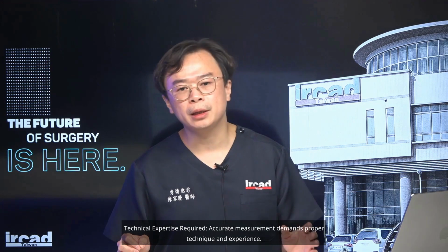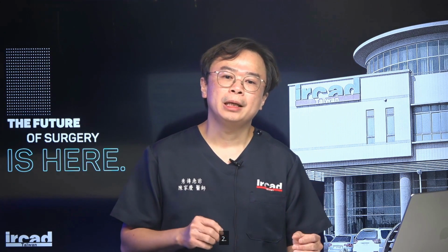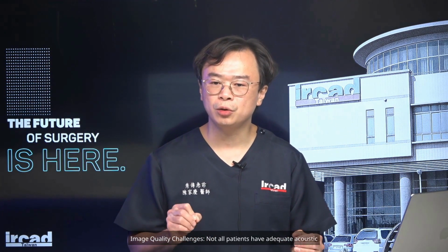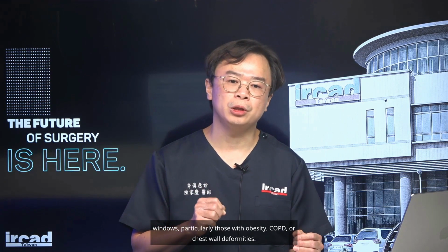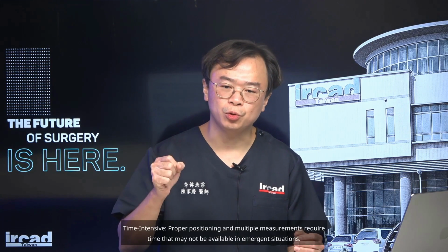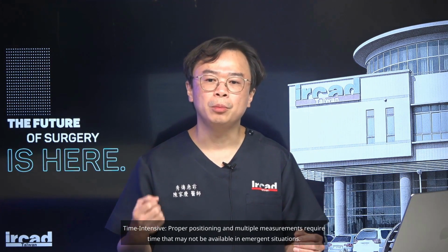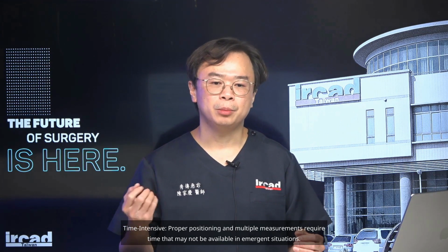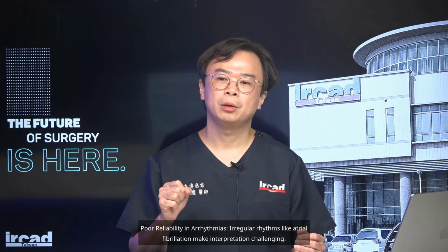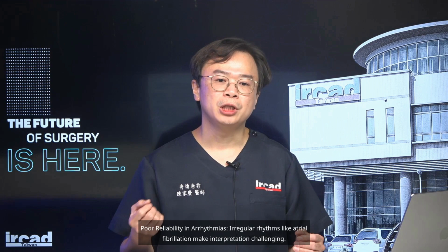Limitations. 1. Technical expertise required. Accurate measurement demands proper technique and experience. 2. Image quality challenges. Not all patients have adequate acoustic windows, particularly those with obesity, COPD, or chest wall deformities. 3. Time intensive. Proper positioning and multiple measurements require time that may not be available in emergent situations. 4. Poor reliability in arrhythmias. Irregular rhythms like atrial fibrillation make interpretation challenging.